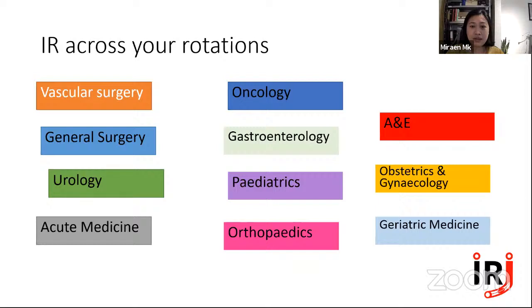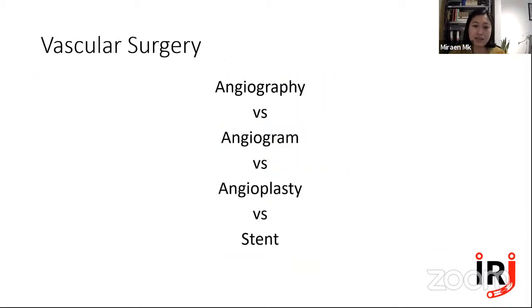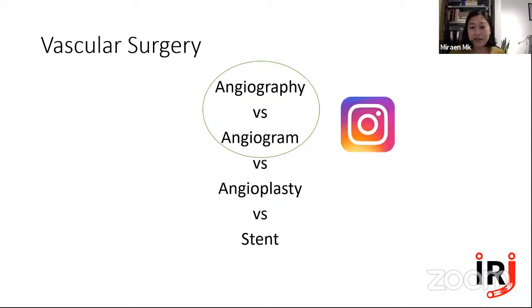To get the ball rolling, I'll just go straight into the big guns, I guess, which is vascular surgery. The first thing that really stumped me when I started my F1 in vascular surgery was what's the difference between these words? Angiography versus angiogram are probably the same thing. Angiography is the act of getting the images, and the image is called an angiogram. The way I think about it, angiogram, Instagram, those are the pictures.